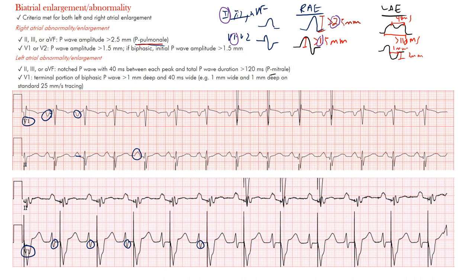For right atrial enlargement, we look at the initial portion in V1 — we don't really see it here. But in lead II, the P waves are peaked at least 2.5 millimeters. So right atrial enlargement was also present, meaning this patient had biatrial enlargement.